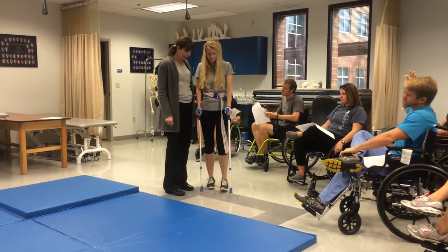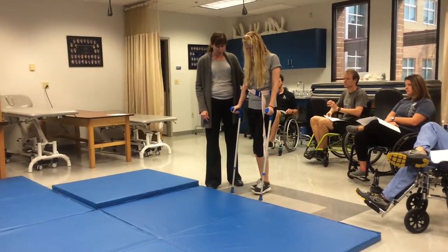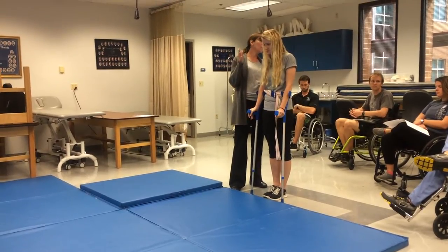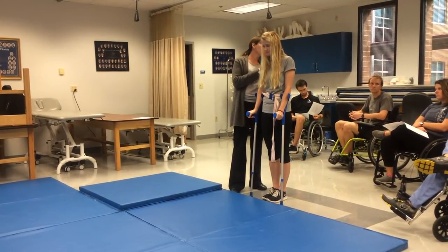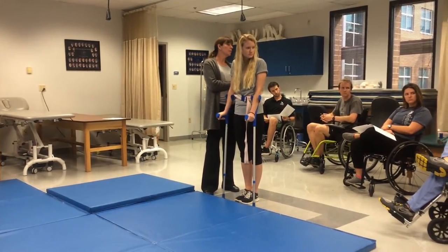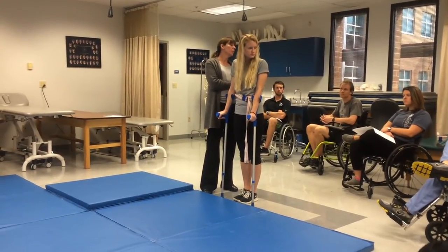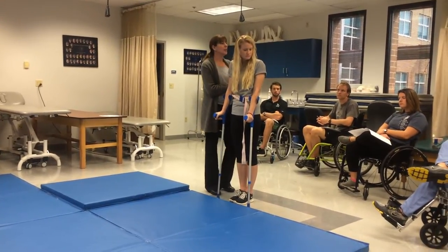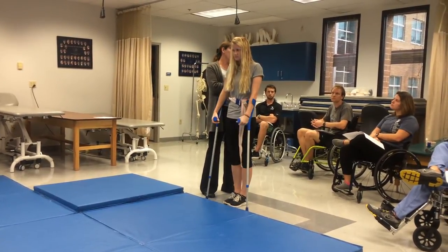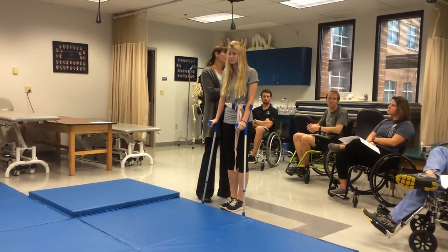One of the things you want to practice is floor-to-stand falls and transfers. With T10, if they're hanging on their Y-ligaments for a couple of years, there's concern about laxity. A patient who uses ambulation at that level is not going to be a full-time ambulator — they'll be a part-time ambulator using a wheelchair, and they will probably develop some laxity changes.